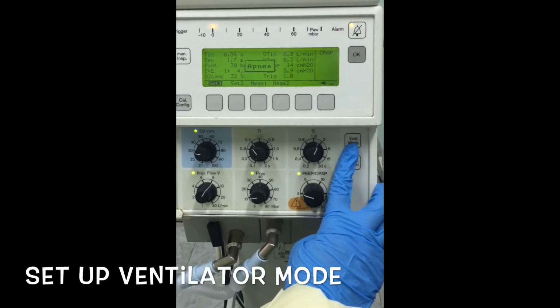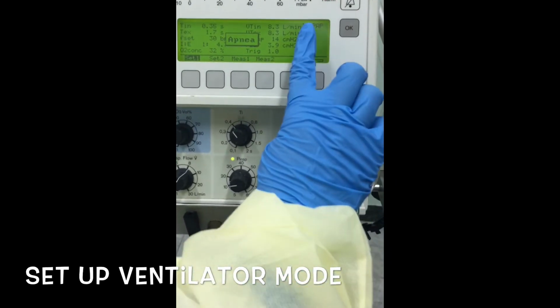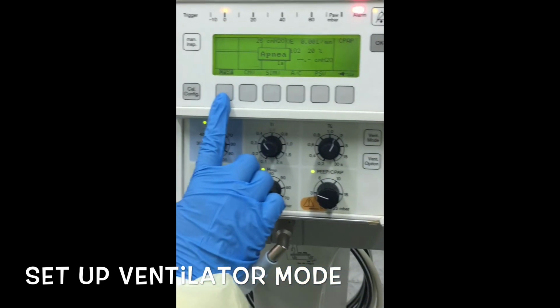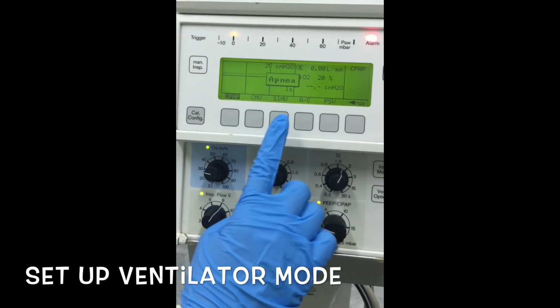In setting up the ventilator mode, you have to press the vent mode button on the right and select on the screen which specific mode is ordered.